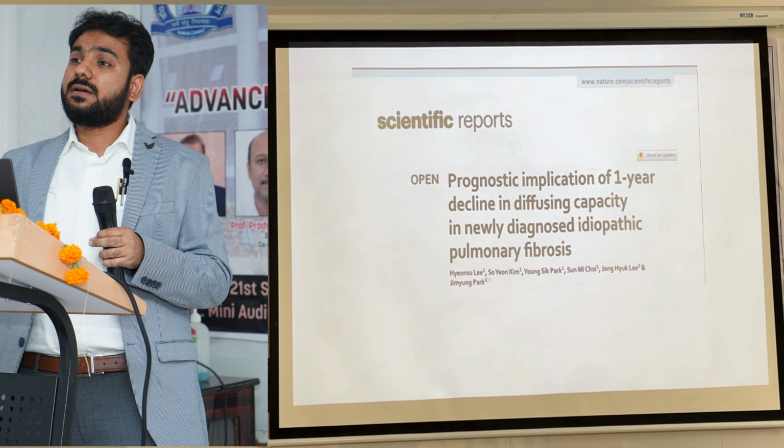Now, why are we talking about DLCO? Is it ultimately leading to a diagnosis? What do you think? Do we make the diagnosis of any disease based on DLCO? Like for diagnosing COPD patients, we say we need a spirometry value of less than 0.7. Then only we can make a diagnosis. So where is DLCO helping? Why are we talking about DLCO?